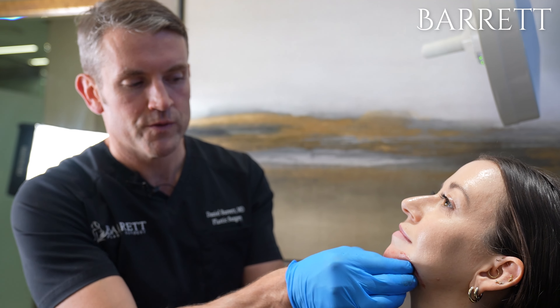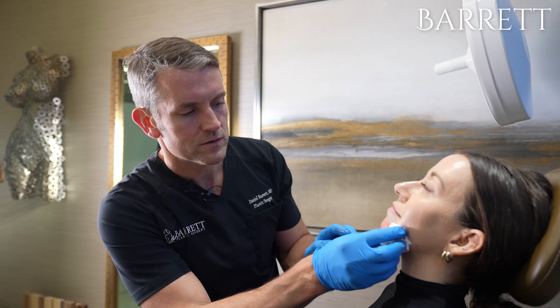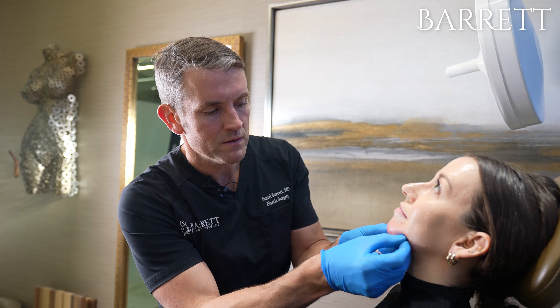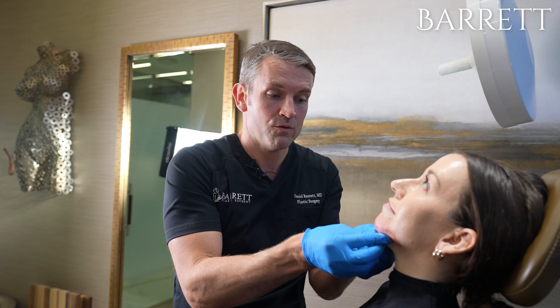It's important after you get your filler to make sure that your provider really massages the area, which we're doing right now — especially with calcium hydroxyapatite, because it can get kind of lumpy. So we're really pushing very firmly on that. And overall, this looks fantastic.